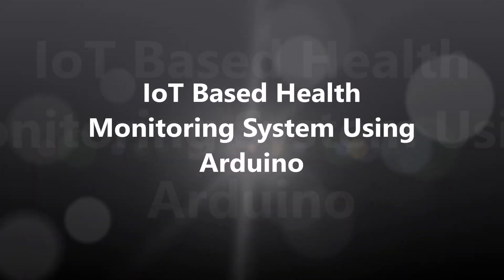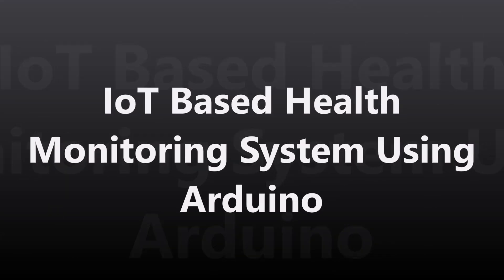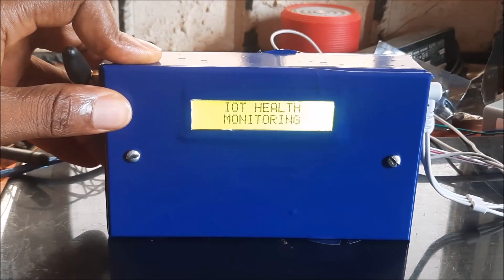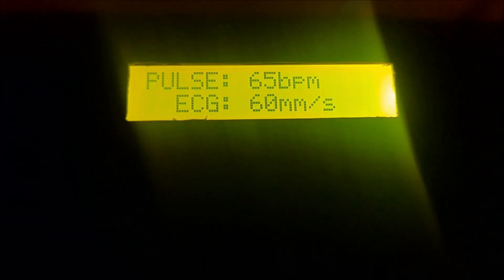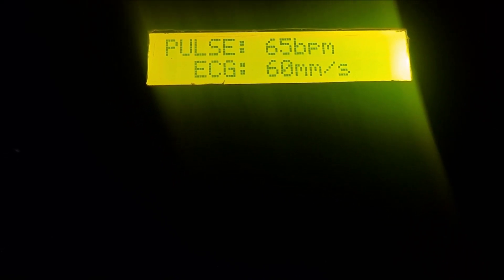Welcome to another video tutorial on how to design and program electronic projects. In today's video, we will be designing and constructing an IoT-based health monitoring system using Arduino. This project will be able to measure body ECG, body temperature, heart rate readings, and pulse rate readings. These readings will be displayed on the LCD screen as well as sent to a ThingSpeak IoT dashboard where they can be further analyzed and remotely monitored.